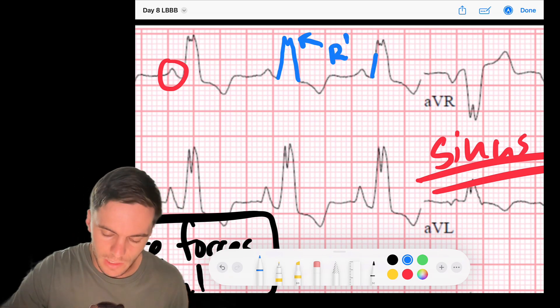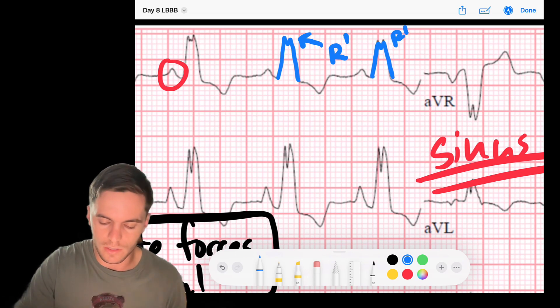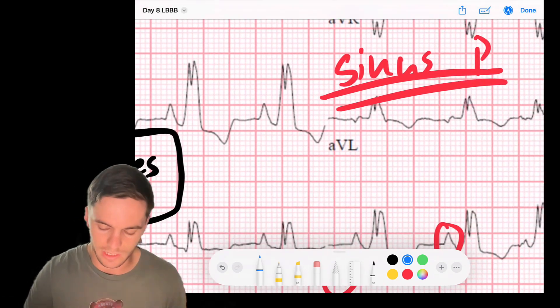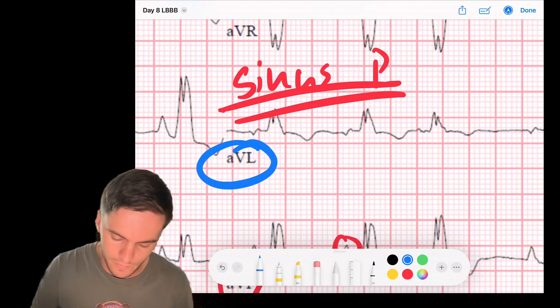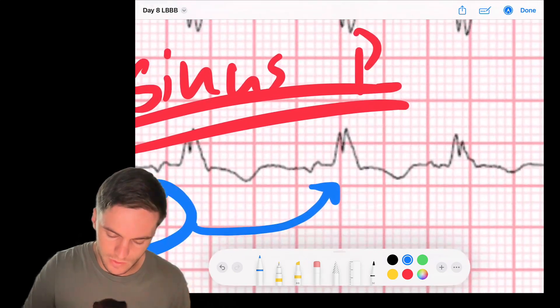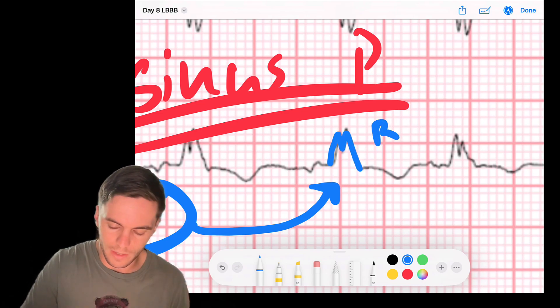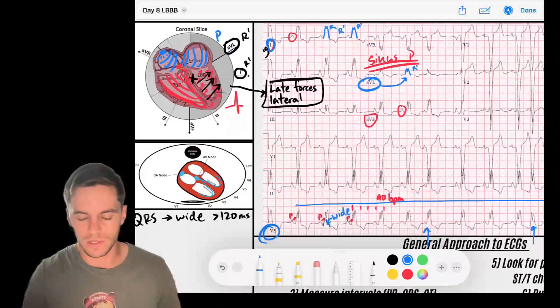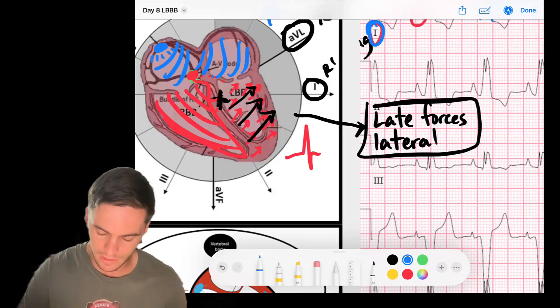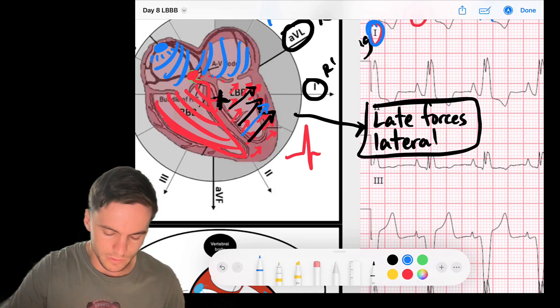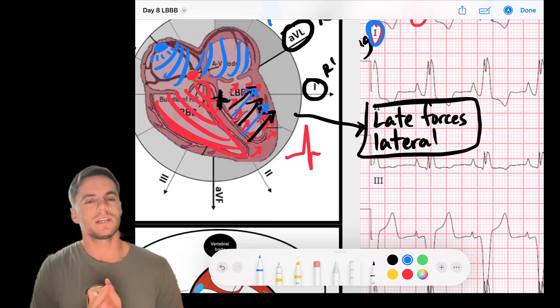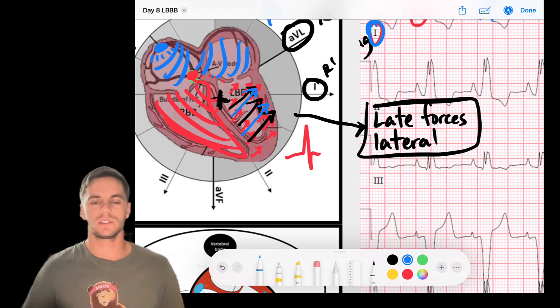So that is late positive forces heading towards lead 1. And then we can also look at lead AVL here. And notice if I look at the QRS complex, you see I've got, it goes up, it's trying to come back down like it usually does, but then it gets this last R prime type of force that is indicative of late forces heading in that direction. So later on in the QRS, that's actually kind of what we would say is the cause of the widening of the QRS is that late slurry force as it's trying to head towards the left side.